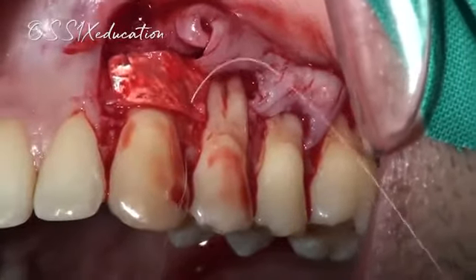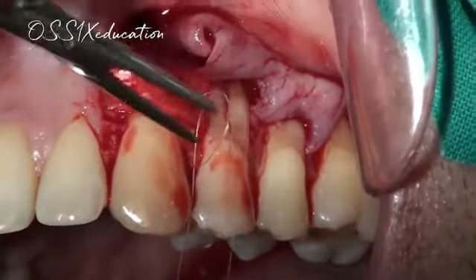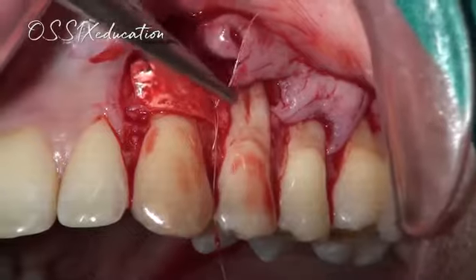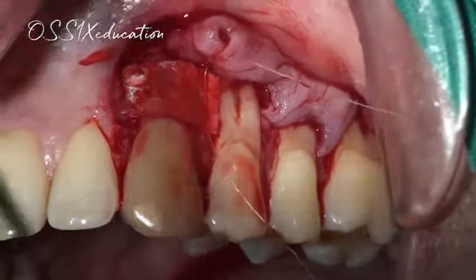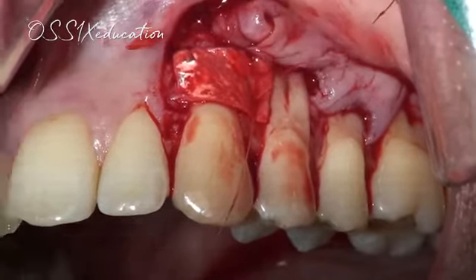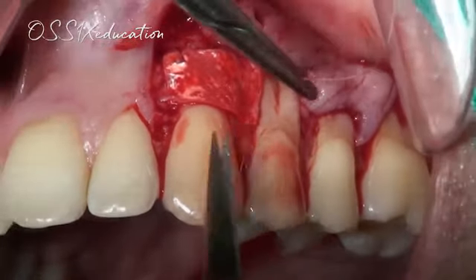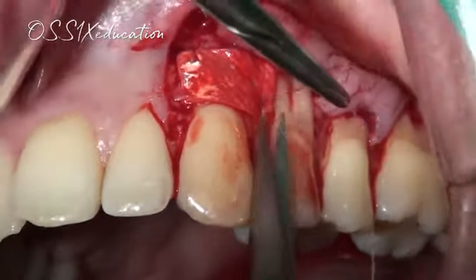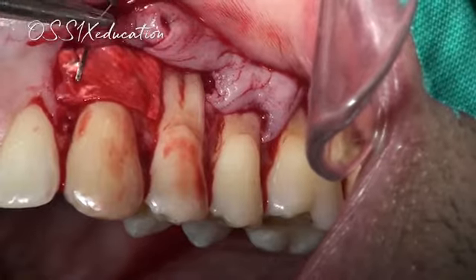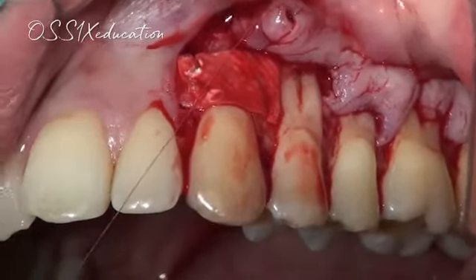So I'm taking a 6-0 resorbable suture. Okay, and we're placing single interrupted sutures. First either mesial or distal, it doesn't matter. And don't overpress because there's no need. And you see how the material is nicely adapted to the root surface. Okay, and then we cut. And now we'll suture the mesial side. Okay, this is good.